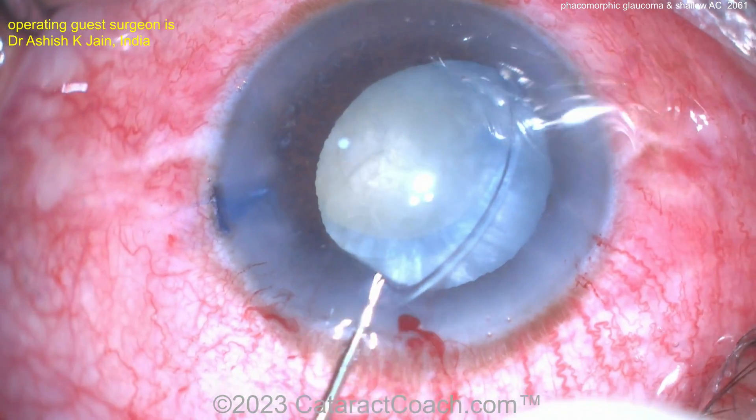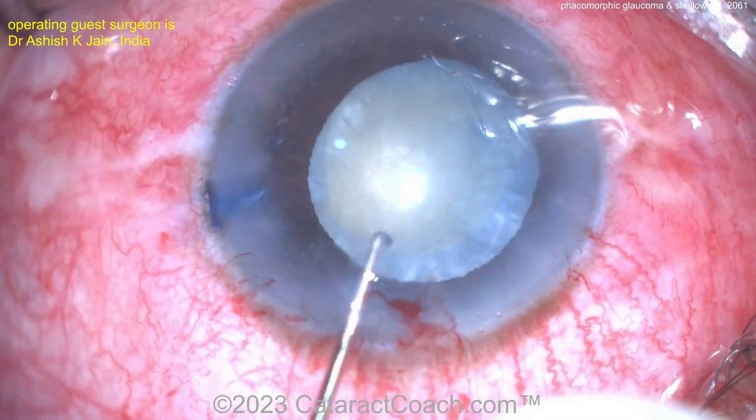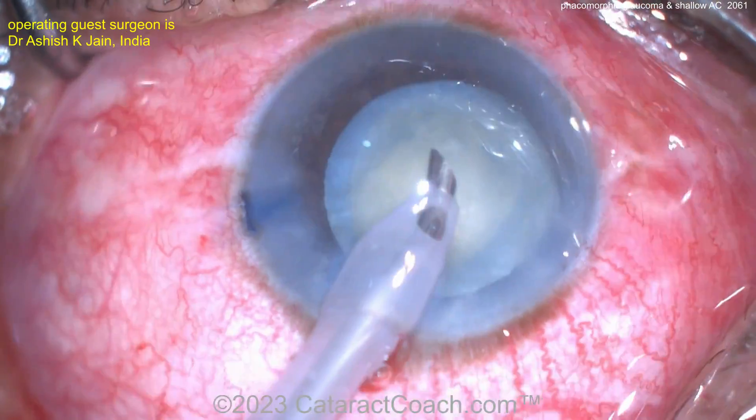But look how much the rhexis moves — look at the position of the rhexis now. Wowza. So now we've got a CTR in.